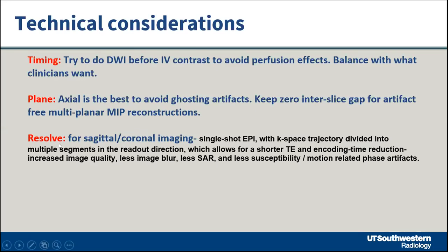Now, for the last few years, I would say the last 4 years, we have been using RESOLVE imaging, which initially came in brain. Now it's available on the Siemens scanners for other areas as well. So we use that for feet, we use that for toes because there are a lot of susceptibility artifacts there. In a nutshell, it's less k-space filling.